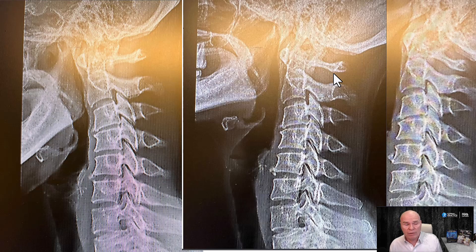We oftentimes get questions from providers wanting us to review their images to see if these images are good enough to send in for testing.